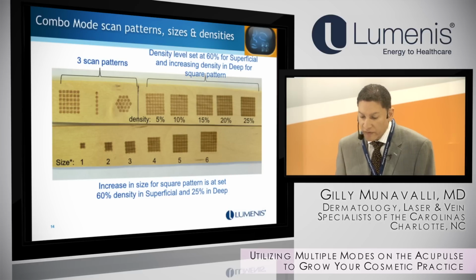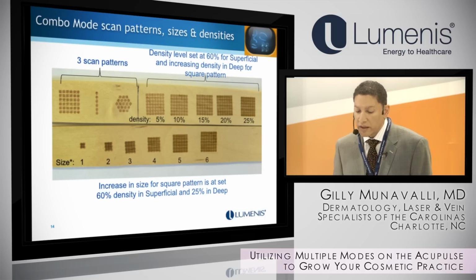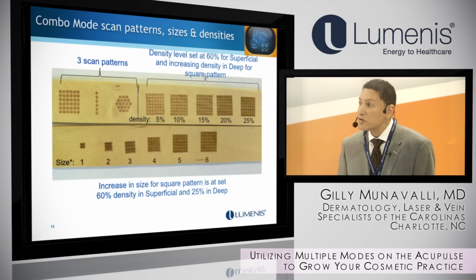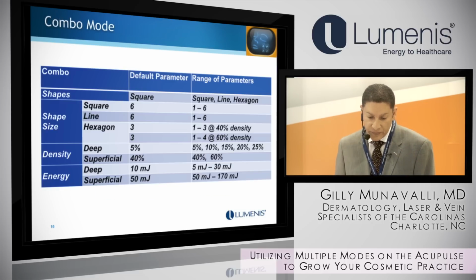And this is what the different densities look like. When I'm doing full face, I'll try to stay as high of a spot size as I can, and I typically vary anywhere between 10 to 20. I usually don't go to 25. It depends with the deep, and I usually stay with the square spot size. I use the linear spot size quite a bit when I'm trying to treat the deep furrows of a wrinkle, so it's very good to have that flexibility.